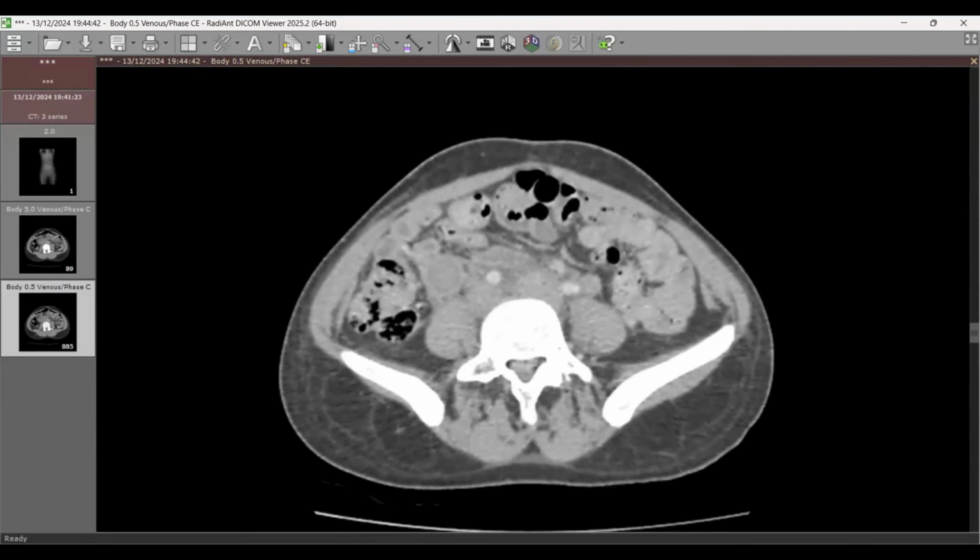Just a little bit of lack of observation here too. I would give you a just pass on this one. Your knowledge was quite good on this. You were a clear pass in knowledge here. Your clinical reasoning was good also, clear pass in that too. Your safety management was also good. You wanted the patient to have immediate anticoagulation. Remember, if IVC is involved in ovarian vein thrombosis, you treat it with the same protocol as pulmonary embolism. Always remember that. So you did well on this case. So this was a clear pass from my side on this case.